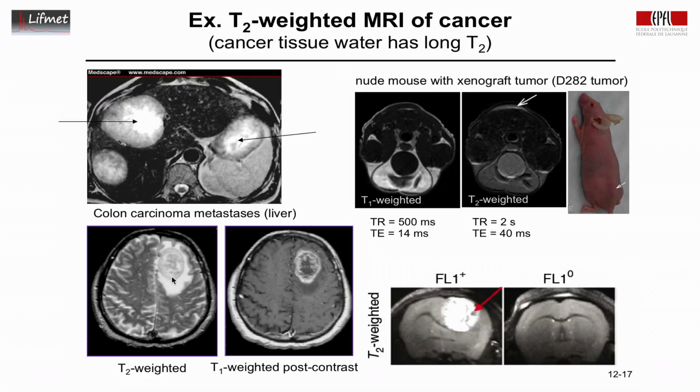And what often is done is the application of contrast agents which depict in the brain a breakdown of the blood-brain barrier or vasculature. And this is now the same patient here, a T1 weighted image after the application of a contrast agent. And that bears now the question on what are MRI contrast agents, which we'll discuss next.